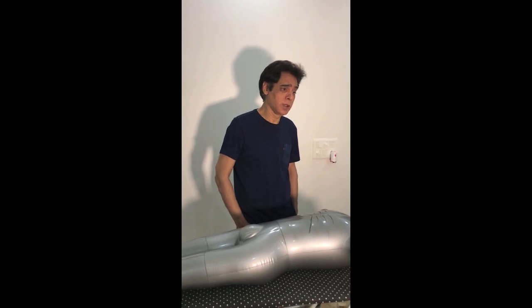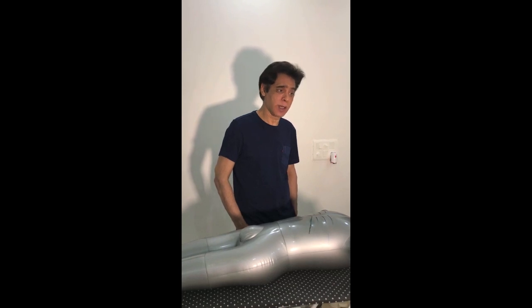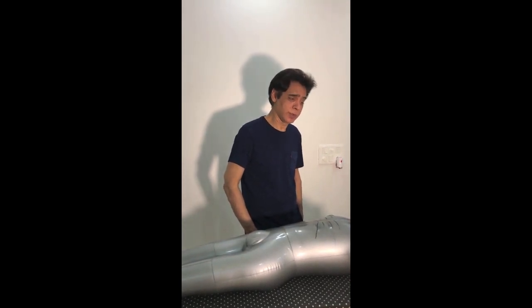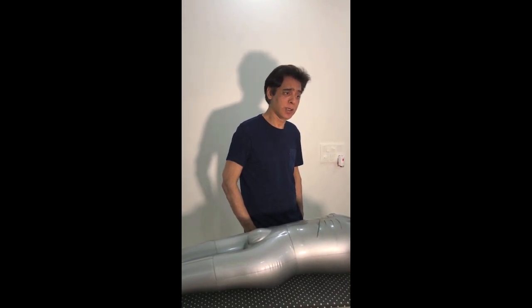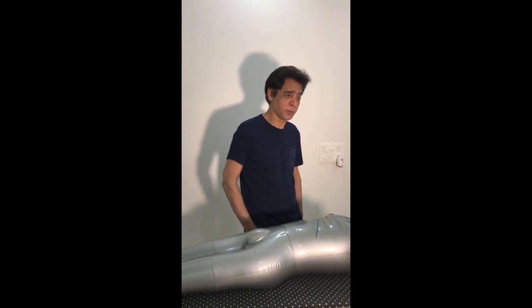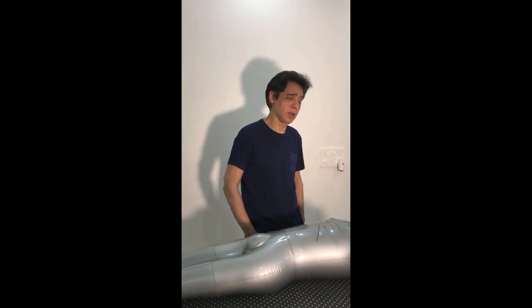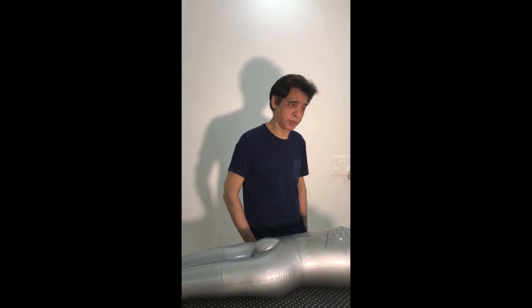Now, we have to start focusing from the proximal to the distal part, and on the way, if you encounter bowel loops to a great extent, then a little bit of manipulation in the probe position can thwart the shadows. A proper patient preparation is also going to help you out, after giving a lot of gas reducing agents and a lot of water. The picture quality will definitely be much better.